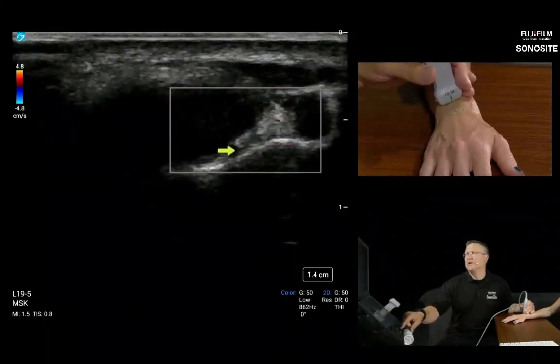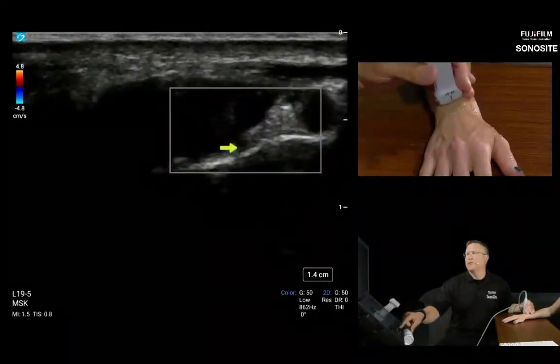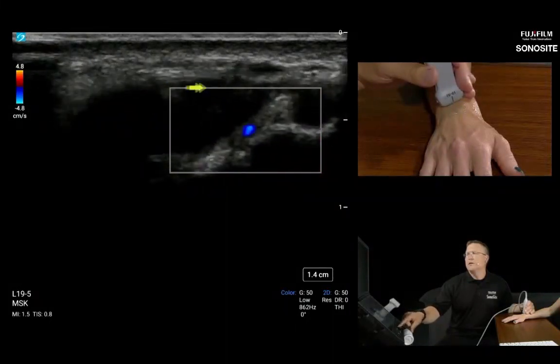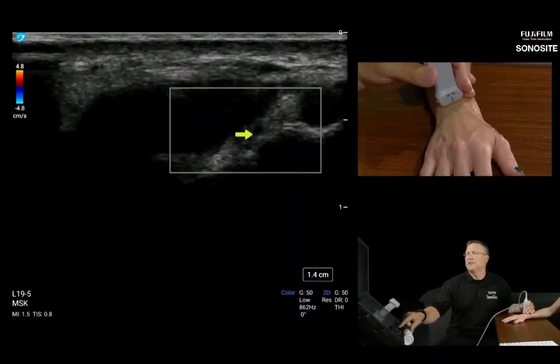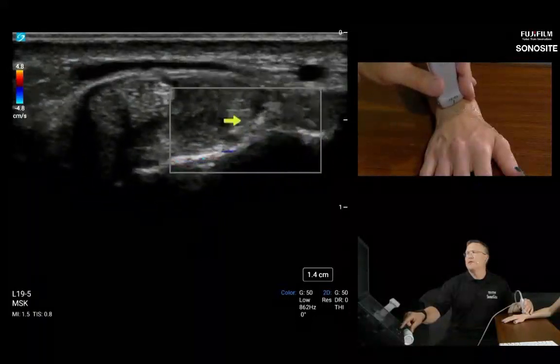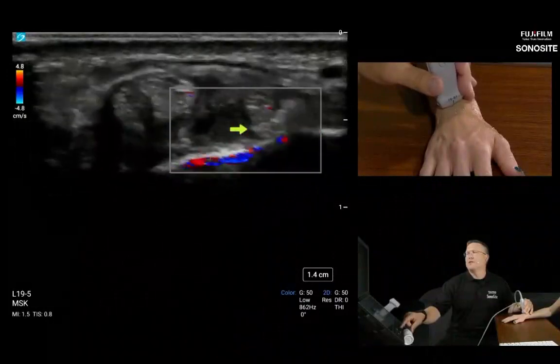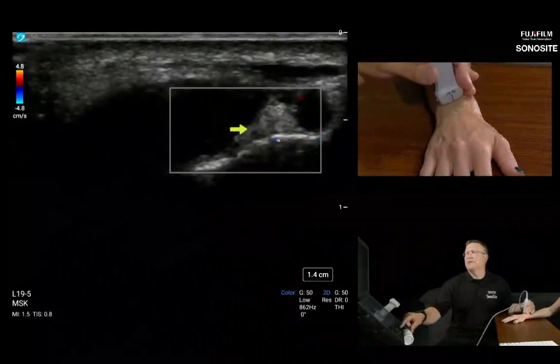If you're scanning small nerves that are accompanied by arteries, like this one, what you have to do is tilt the probe and make a really ugly tendon, okay? All the tendons look bad, but you have to aim down a vessel to make the vessel show up really nice. So you can't remain perpendicular to these small vessels when you know they're a landmark. You can't stay 90 degrees to the vessel. You have to aim down the vessel.